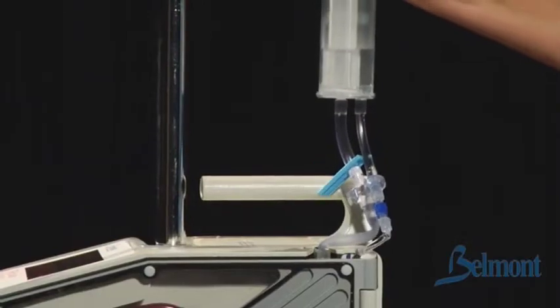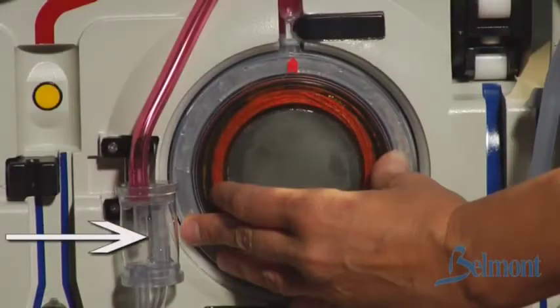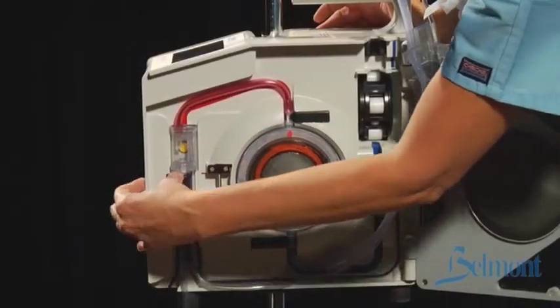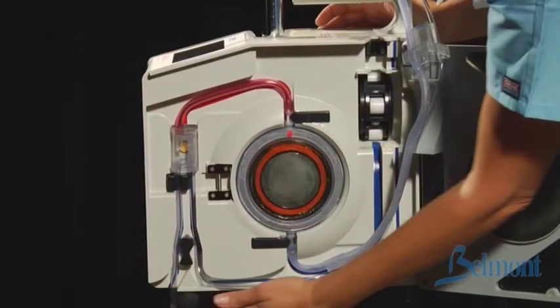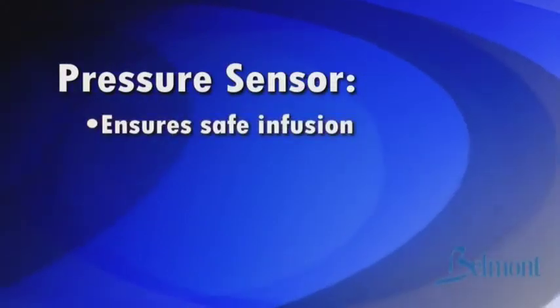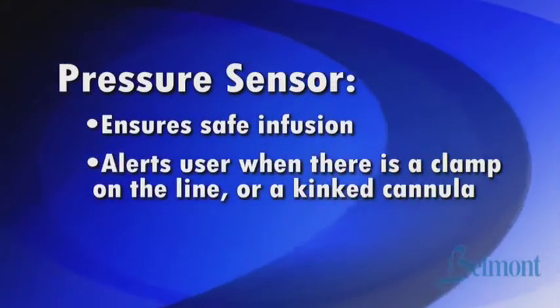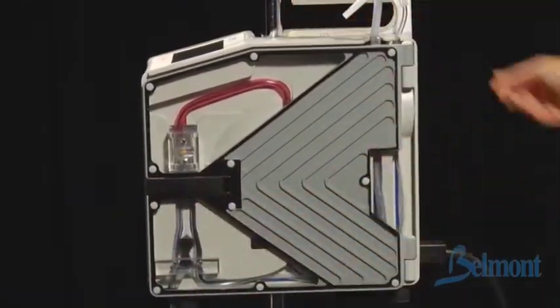Avoid stretching, kinking, or cross-threading the tubing. Now place the pressure tubing into the pressure chamber well. Firmly insert the wider infuse line into the air detector and to the left of the patient safety valve wand. Place the thinner recirculation line to the right of the air detector and to the right of the valve wand. The pressure sensor ensures safe infusion and alerts the user when there is a clamp on the line or a kinked cannula. Close and latch the door, making certain the pump tubing is not caught.